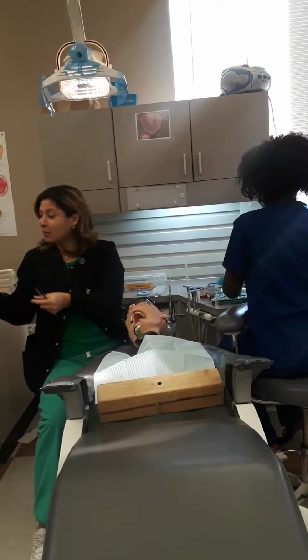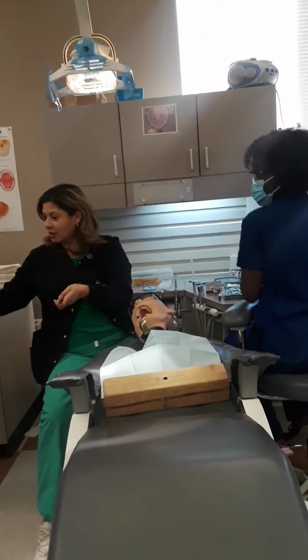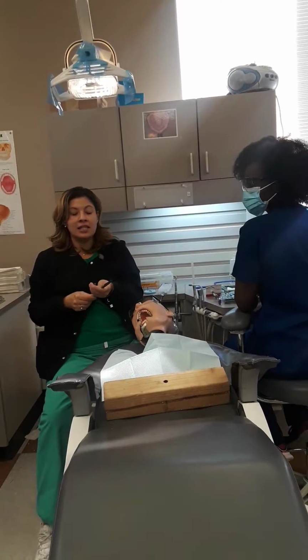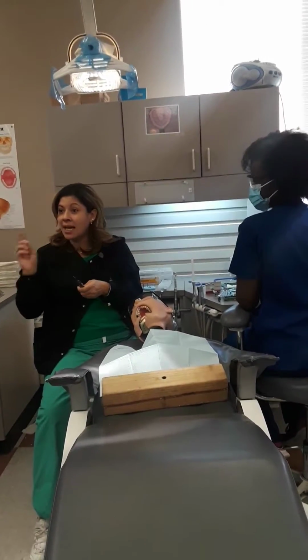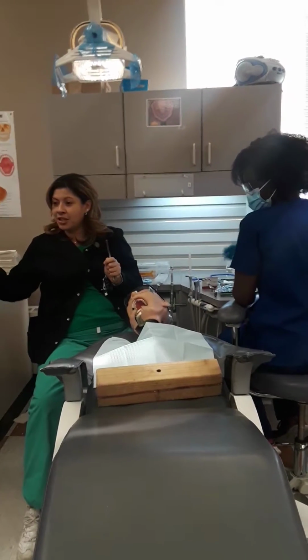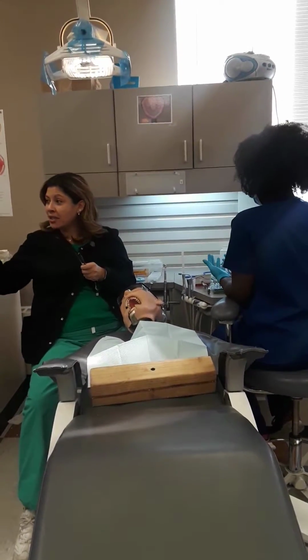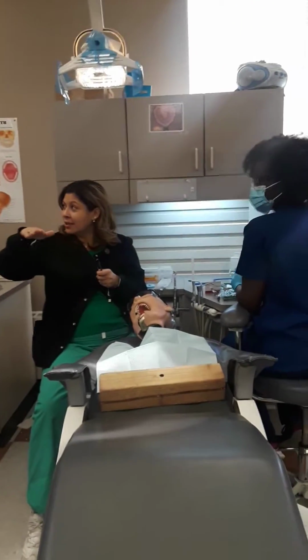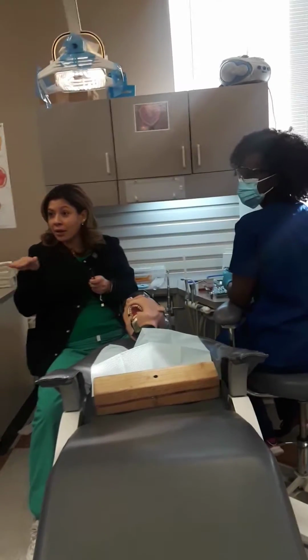Then she asked for a spoon. This looks just like a spoon. You want to touch it, hold it. Okay, spoon excavator removes decay with the hand, so it's a cutting instrument. Then she said refining instrument, this proper name is a GMT. So what we do, that actually levels. So when I use a bur, it's not level. So I'll take that instrument and make sure everything is level, like a floor or door. Make sure it's even. So that's what that instrument does.